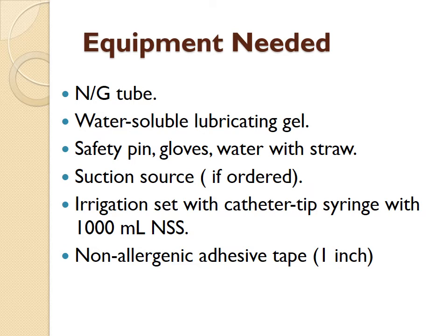The main numbers that you have to remember are usually between 80 and 120 millimeters of mercury. For low continuous, they're going to want it between 80 to 120. For low intermittent, your book states 80 to 100. So as I said, just think in terms of 80 to 120, and we're talking completely about wall suctioning. If you are using some kind of a table device, it will vary because of the type of machinery. You must always check the policy and procedure manual of your facility.